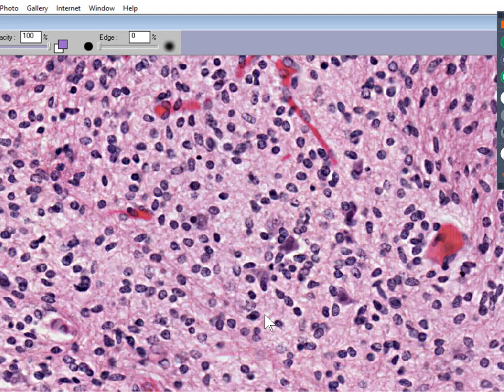They are somewhat pleomorphic, but they're not necrotic. They're not palisading. They don't have the perivascular growth pattern. So this would be a primary glioma brain tumor that is not high grade. Maybe you would call it intermediate grade, or call it whatever you want, but it is going to behave better than a high grade glioma that we saw and we called glioblastoma multiforme.